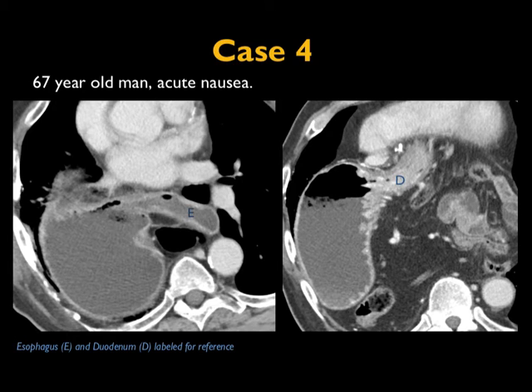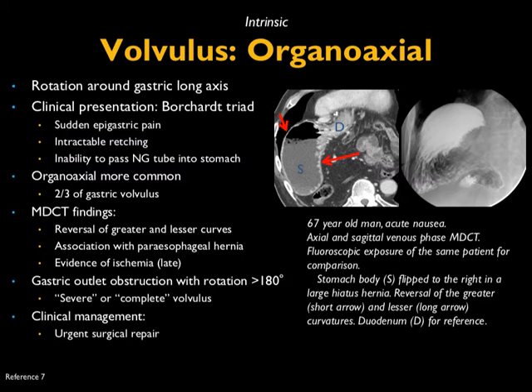Another case: patient with acute nausea. You look at this and ask yourself where exactly is the stomach, where is the esophagus, and is there a twist present? You can see the location of the duodenum versus the esophagus, and recognize this patient has a volvulus — rotation around the gastric long axis, the organo-axial type, which is more common. Clinical presentation is usually abrupt: sudden epigastric pain, intractable retching, and inability to pass an NG tube. CT findings can be tricky — you may think you're dealing with a large hiatal hernia — but notice the reversal of the greater and lesser curvature. It's commonly associated with a paraesophageal hernia.